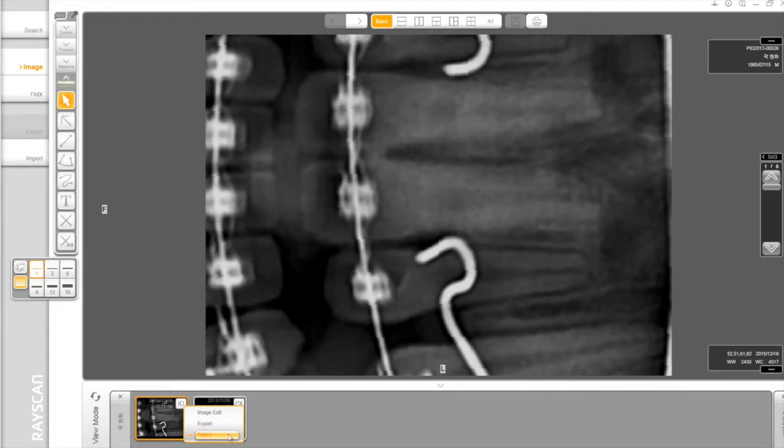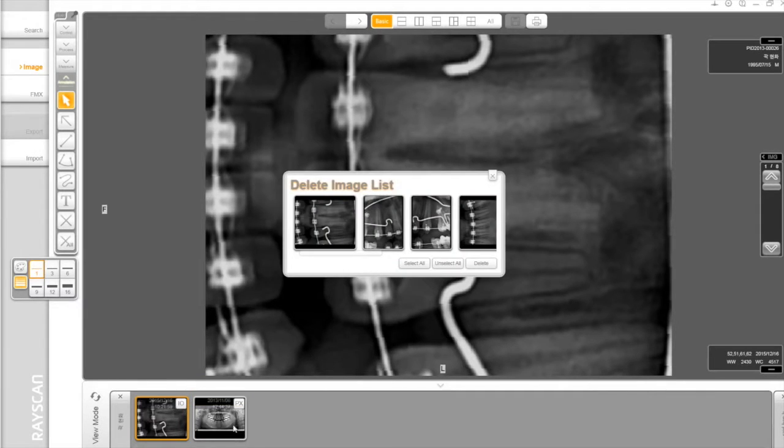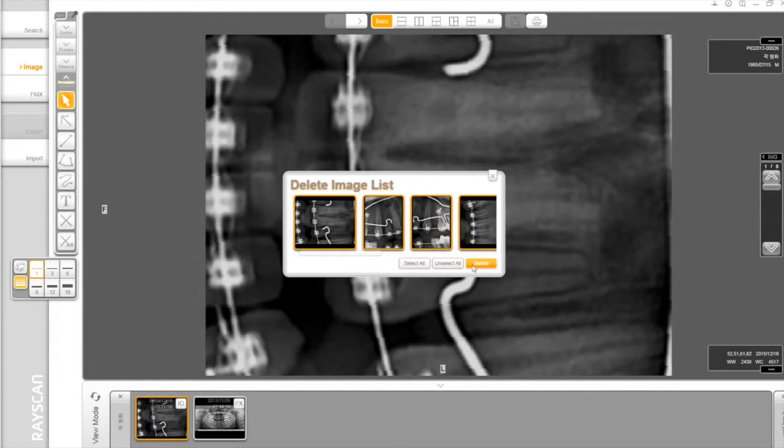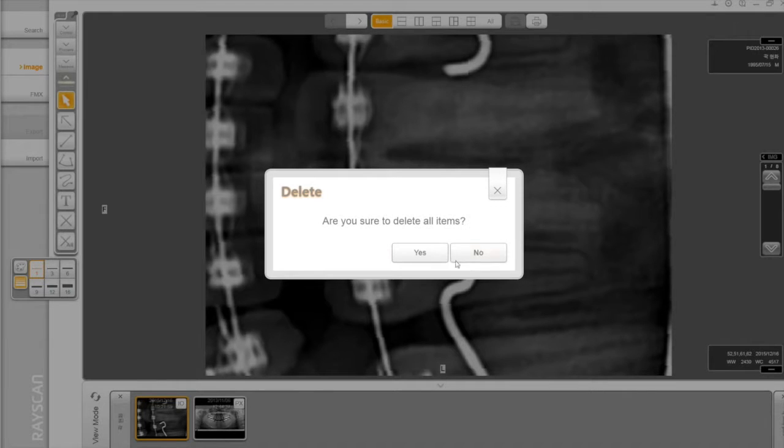To delete the images, select Reject and choose one by one. Or click Select All. Then delete the images.